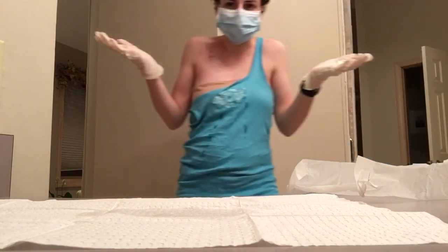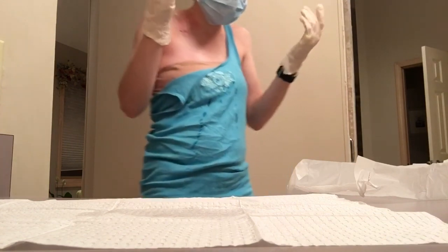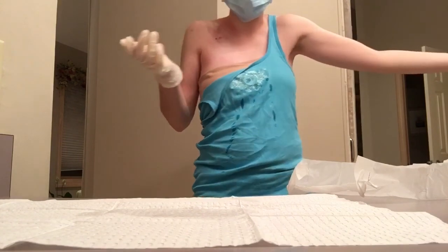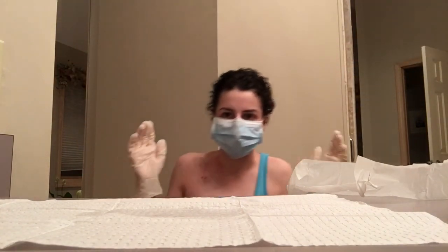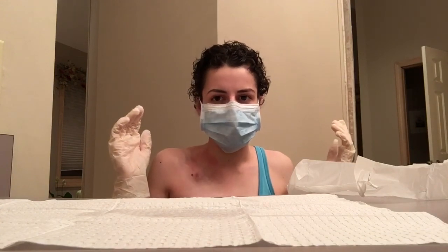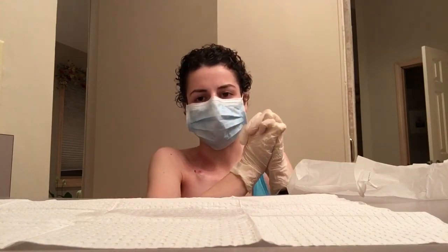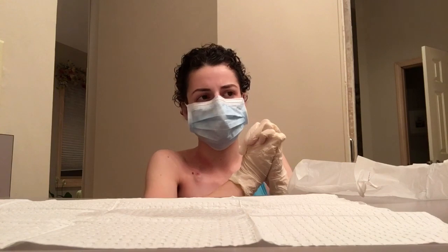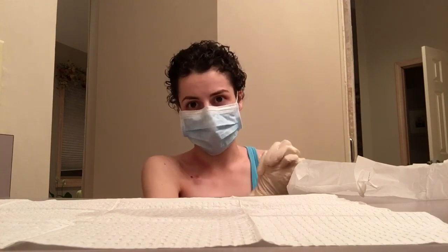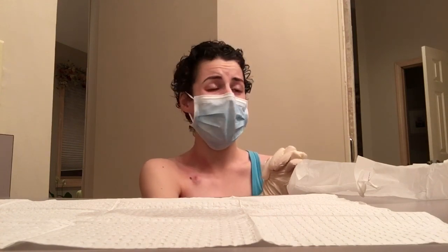And I just hold my hands like this because if I were to touch the countertop, that's not sterile. And then I do have another pair of sterile gloves. I'll just do this over there. So I'd have to change my gloves, or my nurse holds her hands together sometimes when we're doing IVIG, and some days I just don't feel like accessing, but I'll already be accessed for IVIG on Sunday.